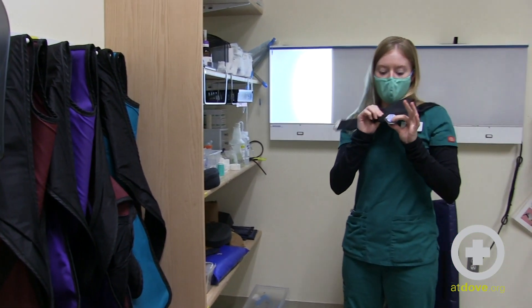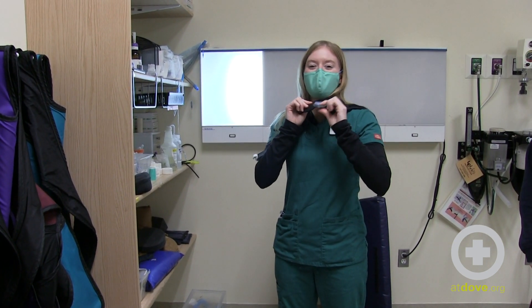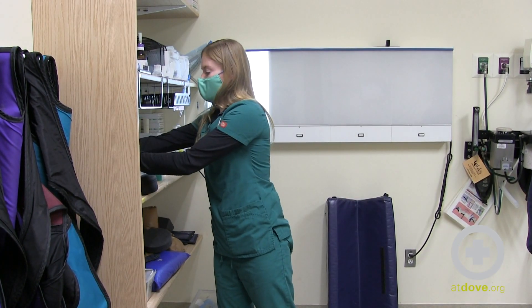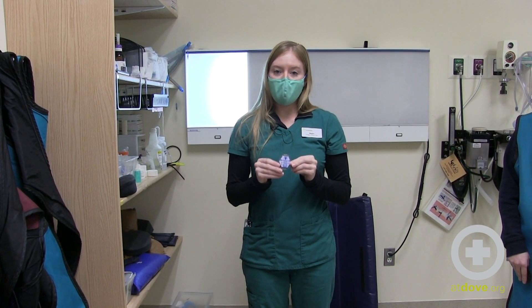Thyroid shields are where you clip your dosimetry badge. As you're taking these off, make sure you're removing your dosimetry badge and storing it wherever your hospital indicates. We store all of our dosimetry badges outside of the radiology suite.